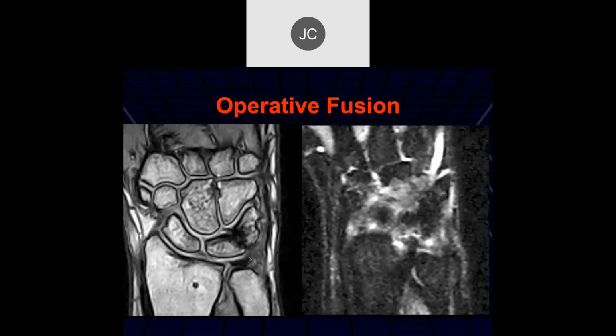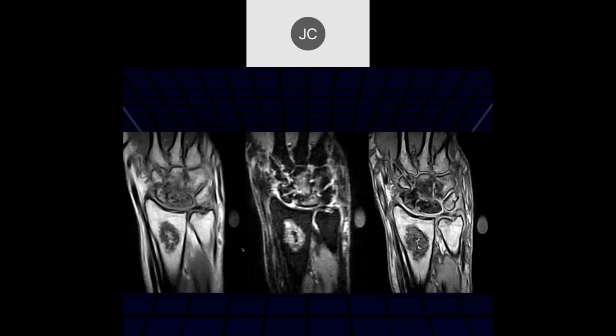In a case like this, you should probably get a CT scan to try to better visualize the bony detail. I certainly agree with that. Yeah. Jason?